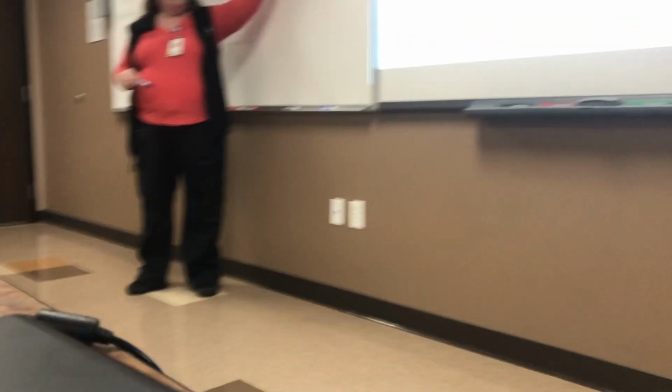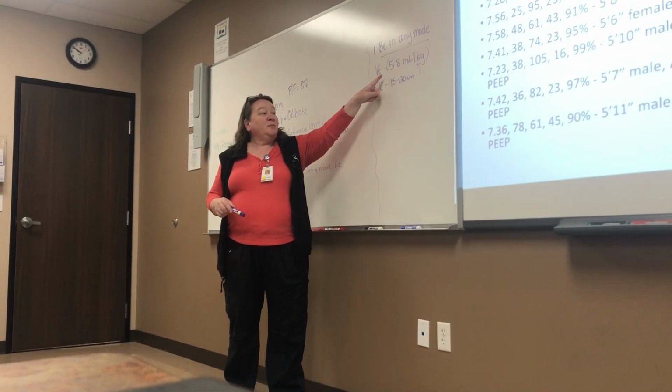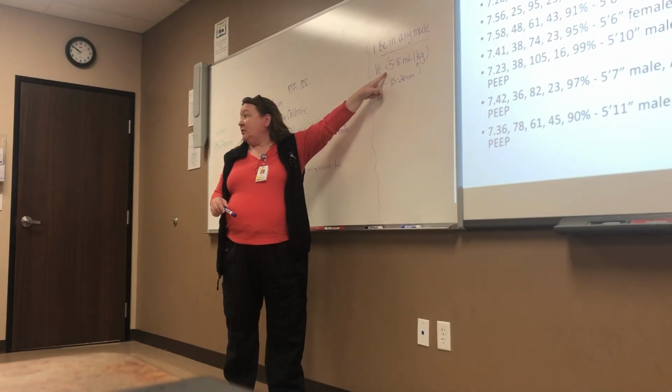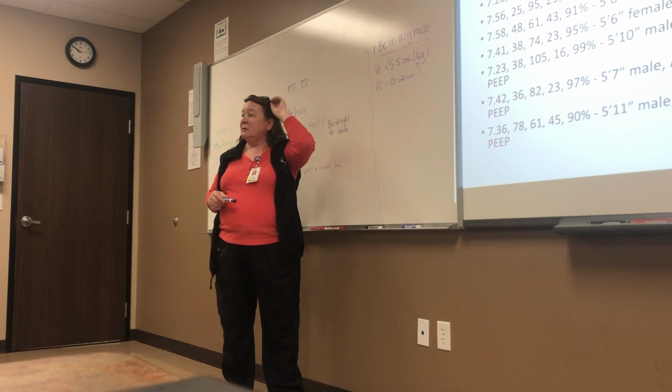So don't think just because you're in pressure control you don't need a volume range, because you still do. Because you're still going to have a target range that you want to use for your patient.